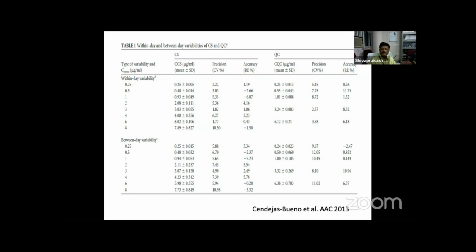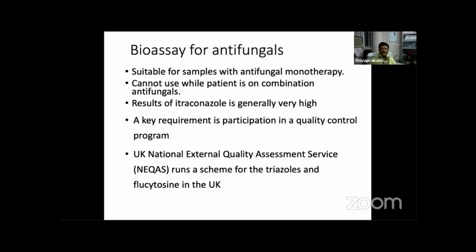Even for posaconazole, we do not have any published data, and we just need to determine it. But it is very early to say that it is very good. For posaconazole there is only 1 publication, and there was not much inference on whether bioassay really gives a good value or not. Bioassay is suitable for samples with antifungal monotherapy.